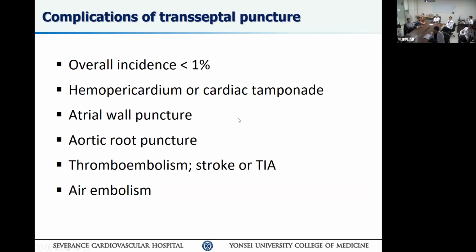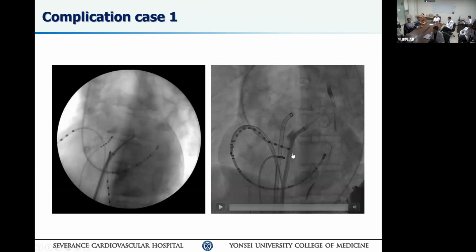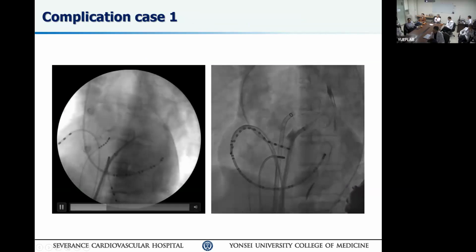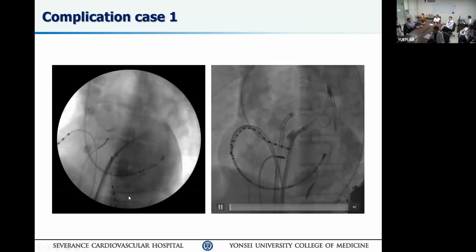Transseptal puncture is a relatively safe procedure, but there are some complications that we can think of. If you see here in the left picture, you can see dye staining in the pericardium.